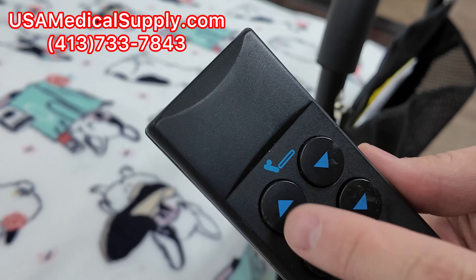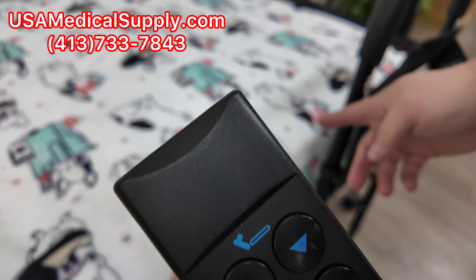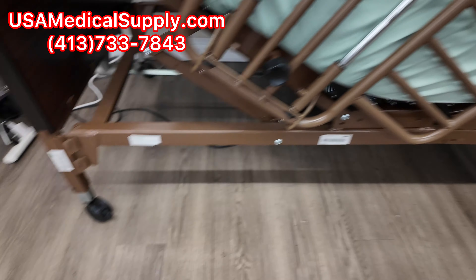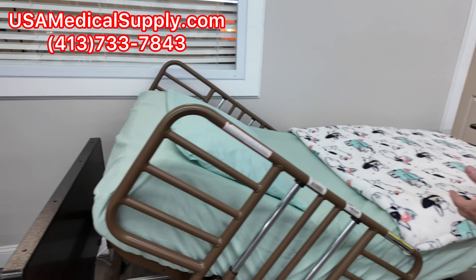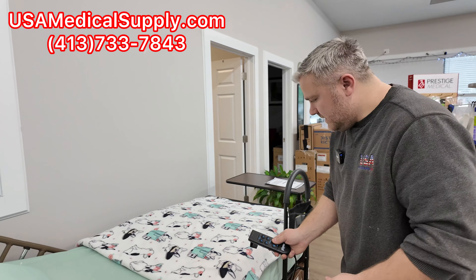This is the remote. The top row raises the head section, the second row raises the middle where your knees are, and the third row raises and lowers the entire bed — great for an aide who is taller so they don't have to bend down too much, and it helps the patient who doesn't feel comfortable leaning down. Call us today at 413-733-7843 and we can drop ship this to your doorstep in a few days.